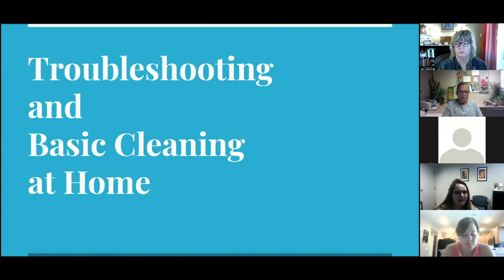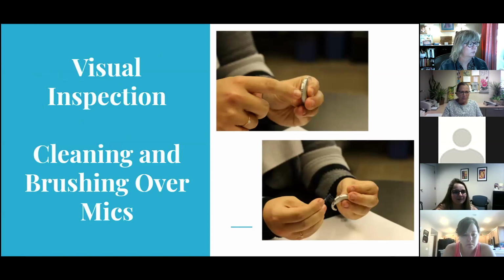So we'll start with some troubleshooting and basic cleaning at home. The first thing in general, if we're ever having issues with our devices, is to do a visual inspection. Make sure that there's nothing cracked or clogged up, or that doesn't look right at all. Especially with hearing aids, that can include cleaning and brushing over the mics. A lot of times your audiologist can give you a little brush, or it comes in the pack. I have some pictures here that show where the little microphones lie on the hearing aids, which can help you find where to go over things to clean them up. I always say that's our first step to see what the issue might be.